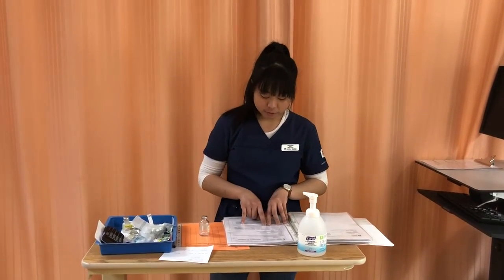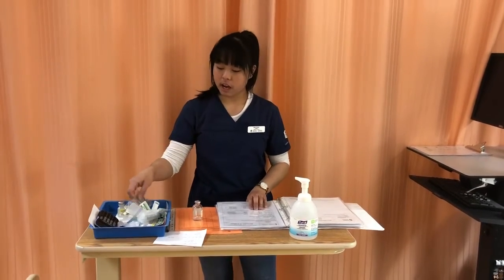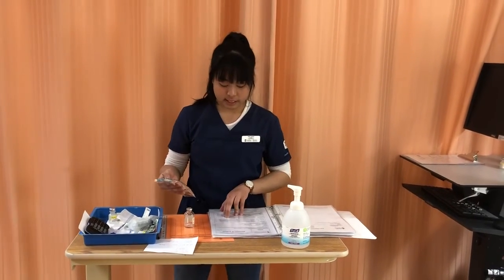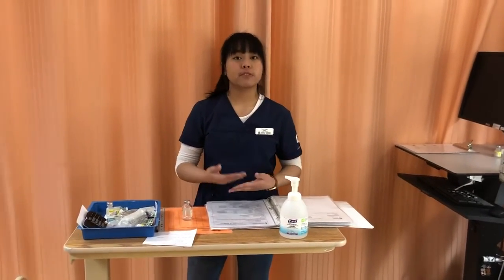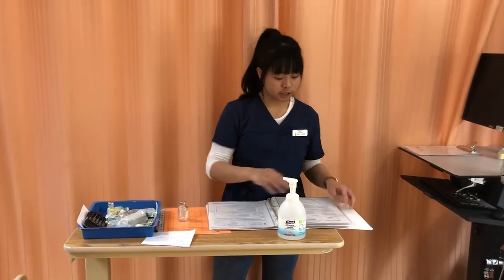So it has to be further diluted later in a 50 to 100 mL normal saline or D5W within 15 to 30 minutes. I chose the 100 mL normal saline because it is the same as our primary infusion, and it is to be infused within 30 minutes because it's the patient's first time having it, so we can intervene if any of the side effects occurs. So I also checked the compatibility with the primary infusion, so we're good with that.